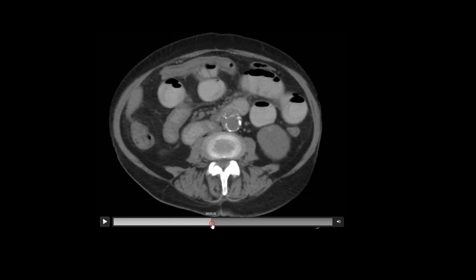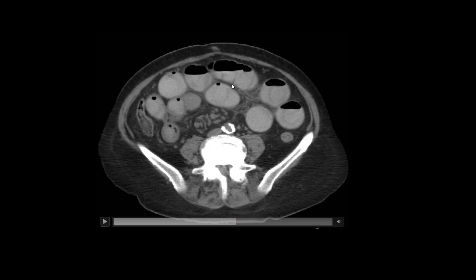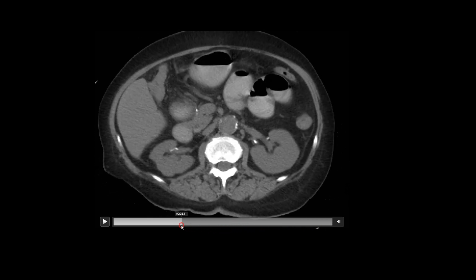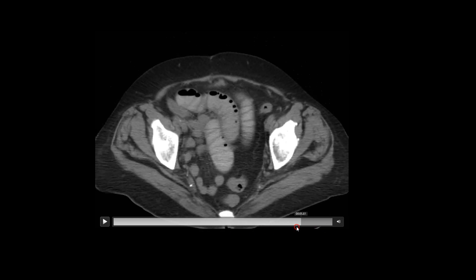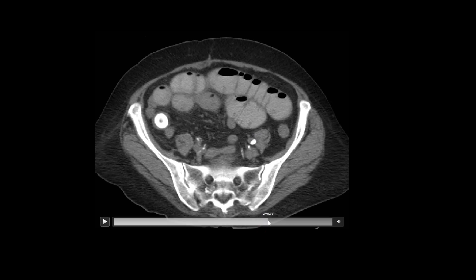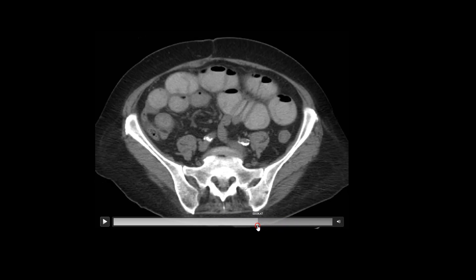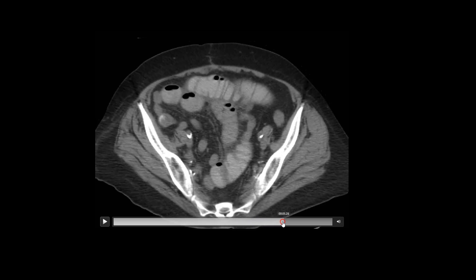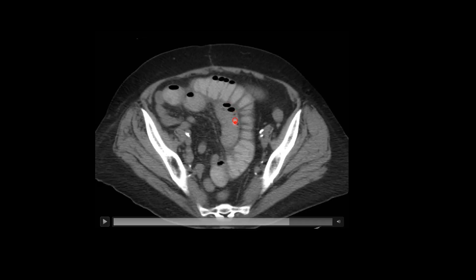Moving inferiorly, notice all these dilated small bowel loops. Small bowel tends to be less than three centimeters in diameter, so these are abnormally dilated, which raises suspicion for a bowel obstruction. You can also get a sense as to why we didn't see as many dilated small bowel loops on the x-ray — particularly the supine view — because the bowel is fluid filled, which can reduce sensitivity for detecting small bowel obstruction on x-ray. Notice how many of these tiny foci of gas are non-dependent and have a string of pearls appearance — a chain of tiny dots of gas on x-ray that can clue you into a small bowel obstruction.